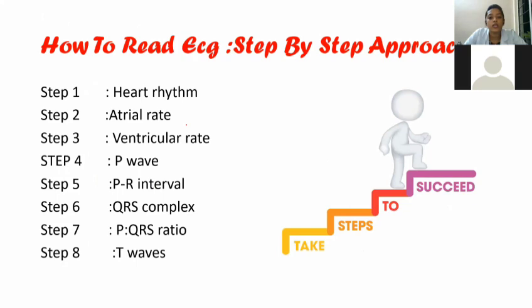So next we are going to discuss how to interpret or read an ECG. Okay, so it is a step-by-step approach.